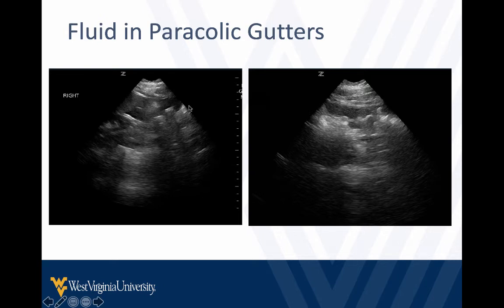So this is fluid in the paracolic gutter here. Here we see the bowel kind of outlined, and we see fluid in the paracolic gutter over here. So keep those in mind. Potential space that if you don't look, you will miss fluid in the abdomen.